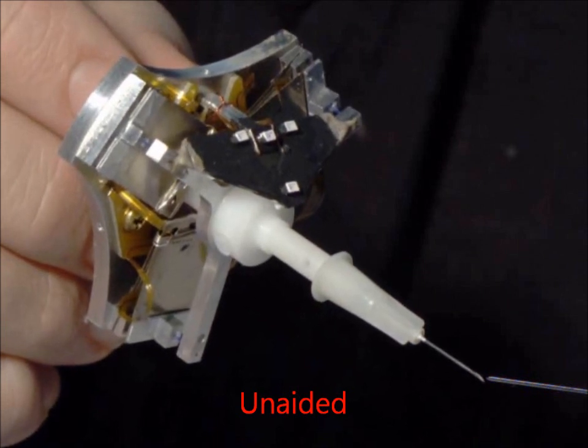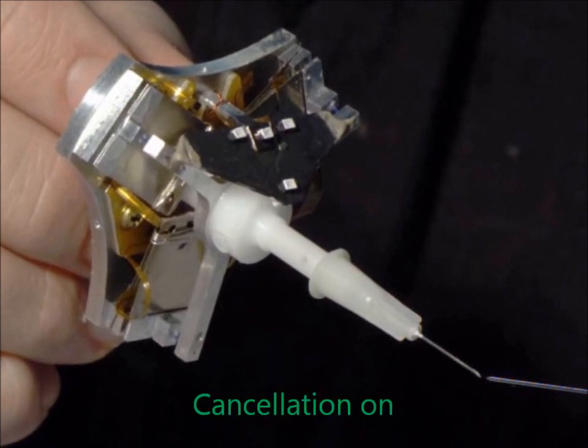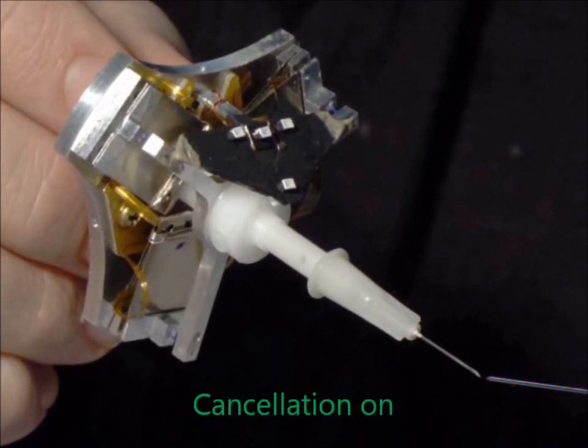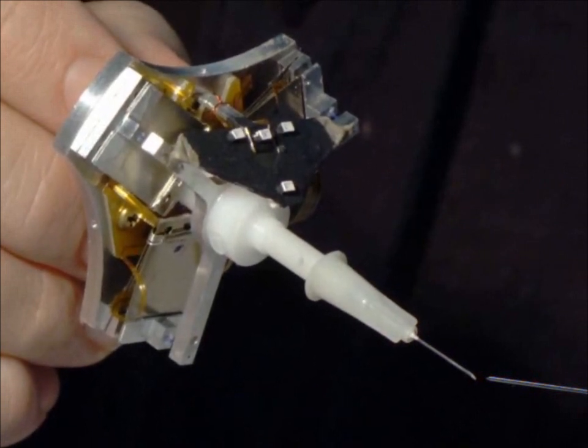In unaided operation, the actuators are disabled and the handpiece functions as a conventional rigid tool. When cancellation is enabled, the actuators move so as to keep the tip stationary, even though the operator's hand is moving.